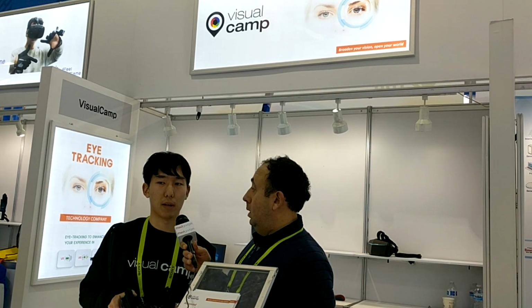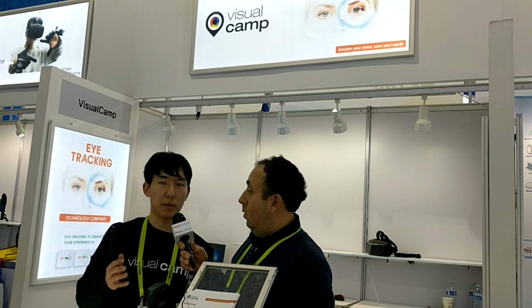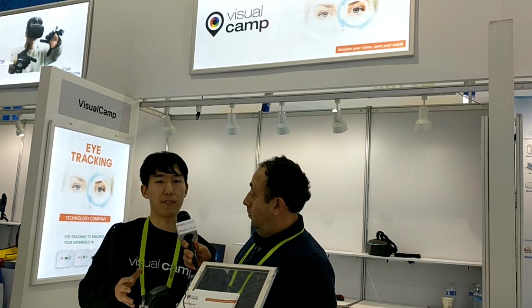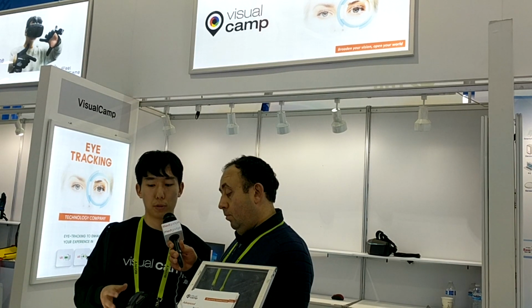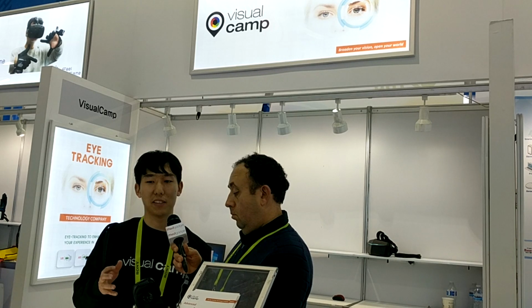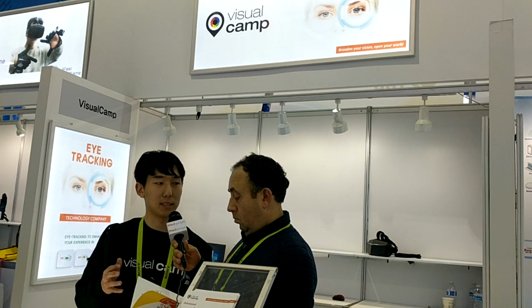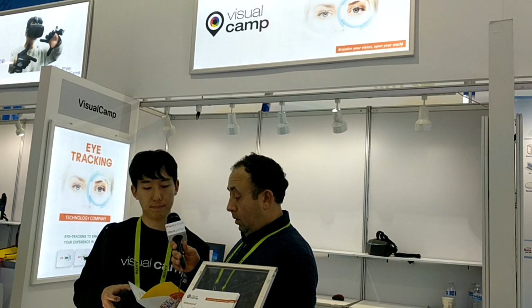Yeah, for glaucoma, an initial symptom can be partial blindness. That is very easy to check, because the calibration process, which is the starting process of eye tracking technology before you use it, is just fit for checking the partial blindness of a patient. We can use it.